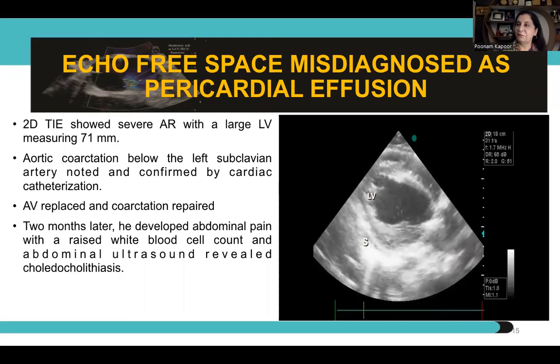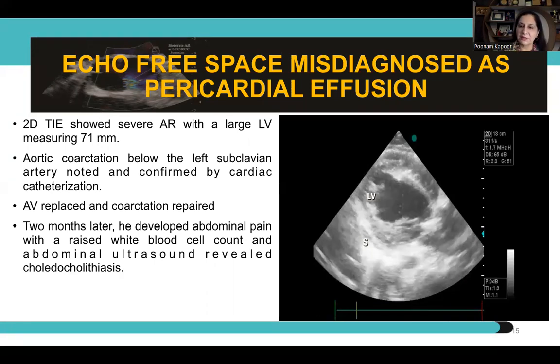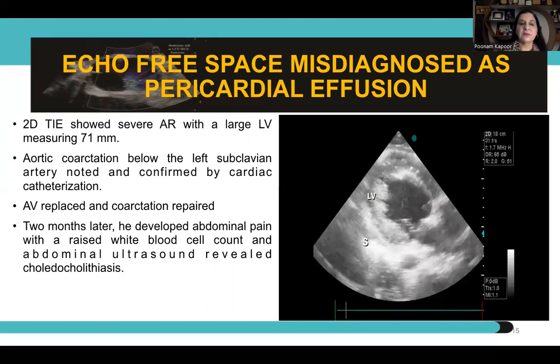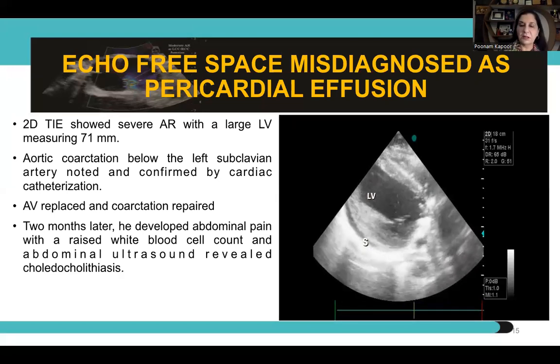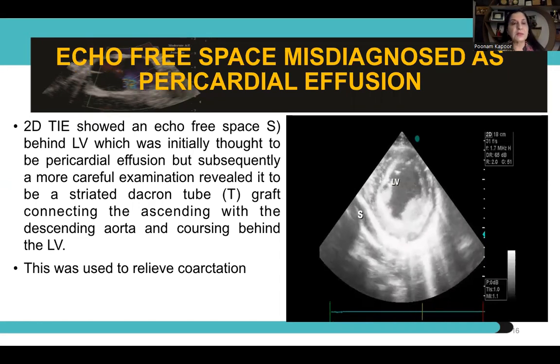And this fluid is very, very minimal compared to the space that we are seeing, which is actually the graft which was juxtaposed in the coarcted areas during the repair. And there was a choledocholithiasis. This patient had a cholecystectomy done, and the patient was sent home.